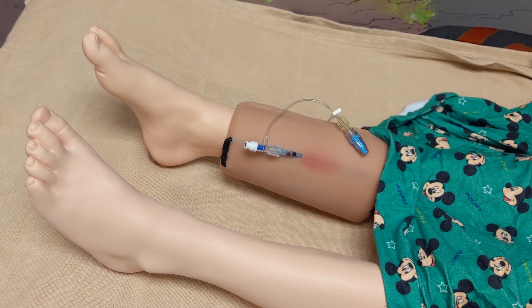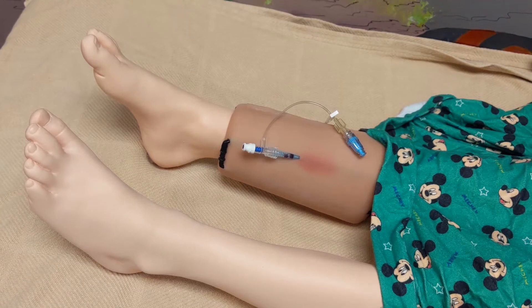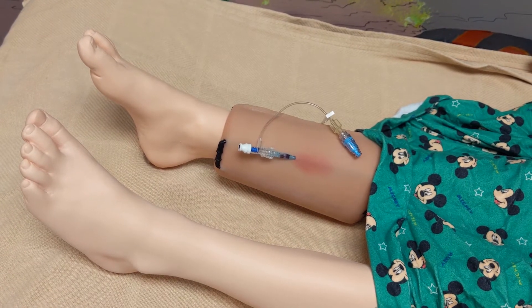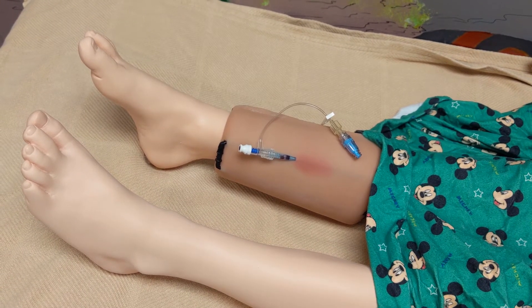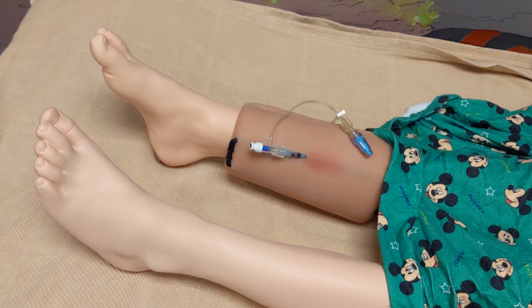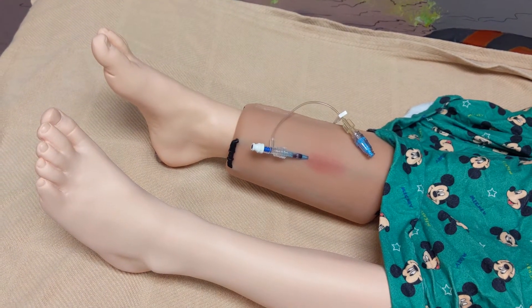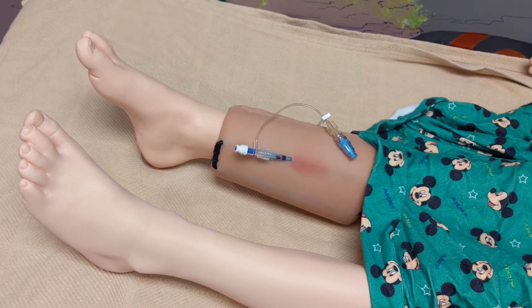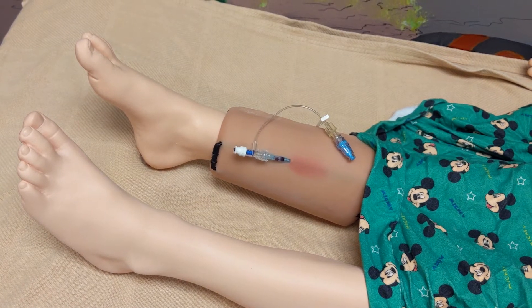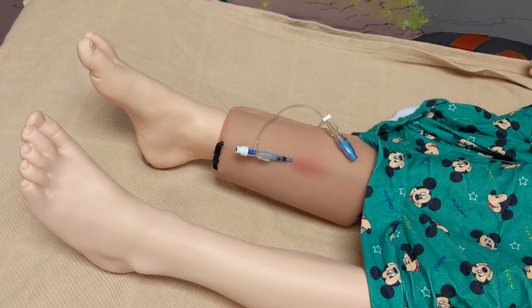The purpose of this video is to demonstrate how to measure a peripheral IV infiltration. I came to assess my patient's IV during my one-hour check and I noticed that it was swollen and slightly red, so I need to remove the PIV and measure the swelling site.